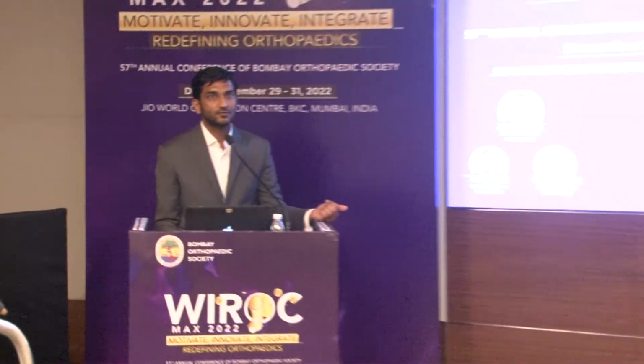Okay. And do you always keep your conventional set of instruments? It's always there, of course. To cross-check with the system, even intraoperatively? No, that has already been done. So that's why they came out with the system, right? When they release a system into the market, they've already done this. So then, of course, if you have your individual paranoia, then you will do it for your initial cases and see. But most of this paper actually tells you that since you're able to achieve eventually what you're planning, then why do you want to cross-check again with your conventional jigs case to case?